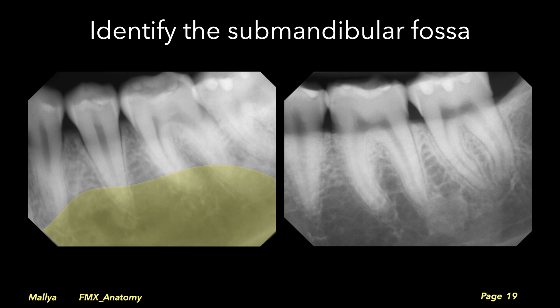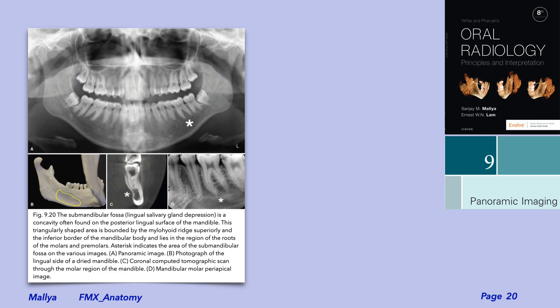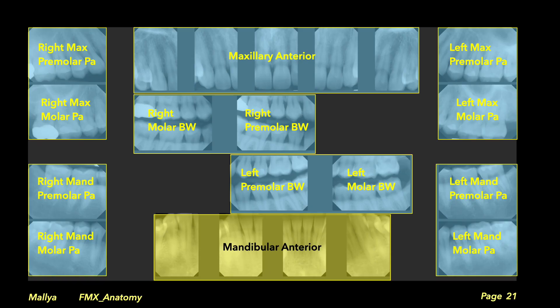Note that the trabecular bone on the inferior portion of the radiograph appears slightly more radiolucent. This is a projection of the submandibular fossa, a depression on the lingual surface of the mandible. This is an anatomic variation and can be seen on both periapical and panoramic imaging.